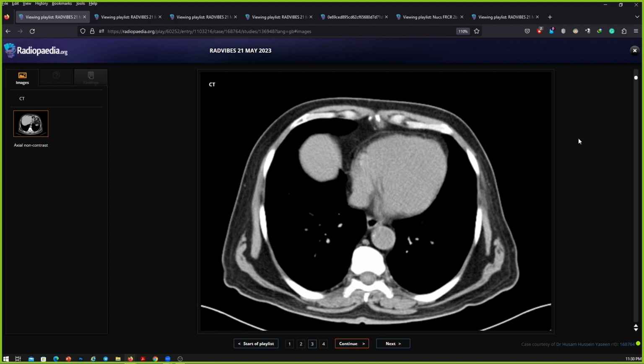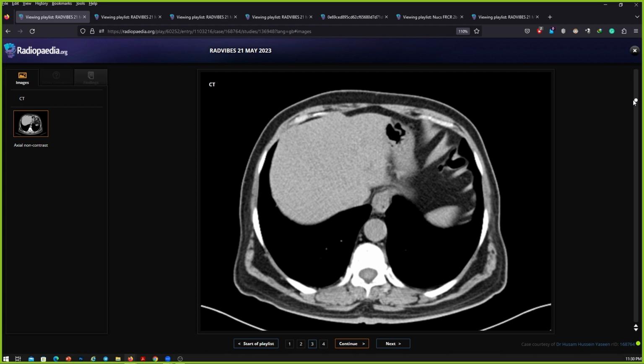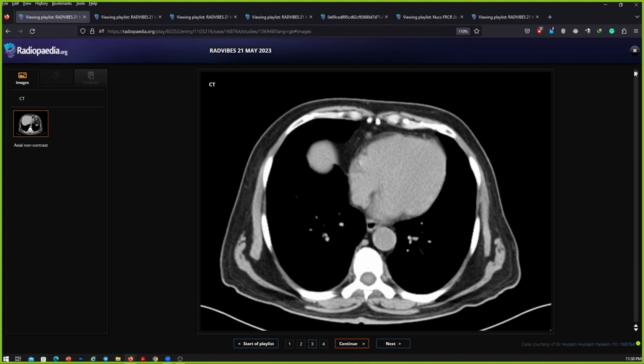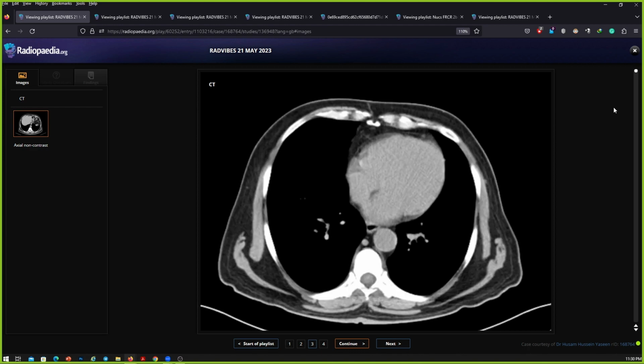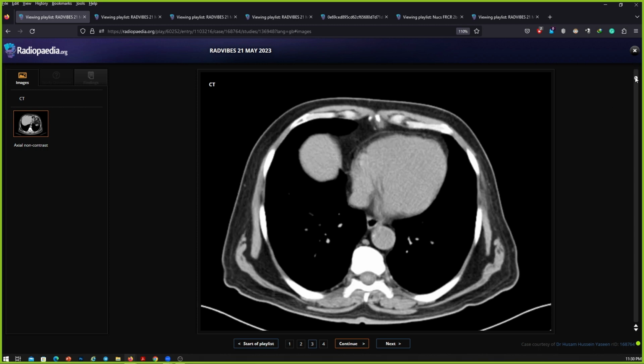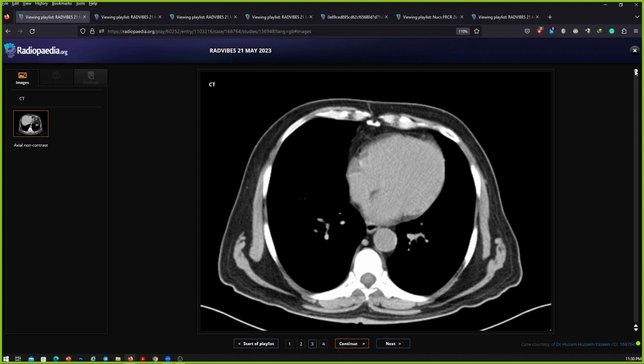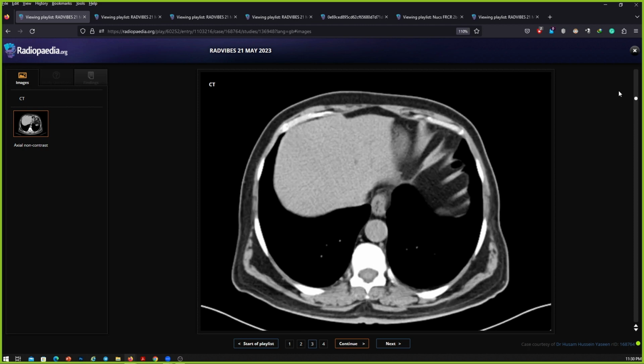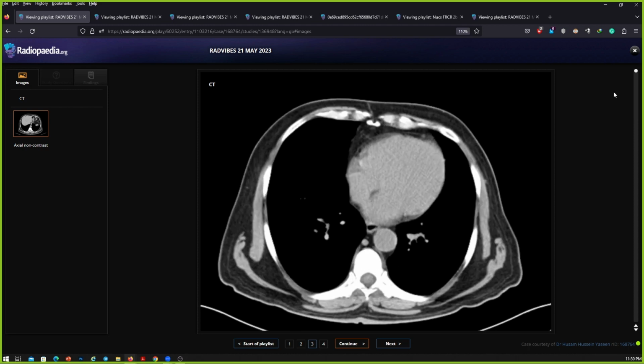You can either use this method that you're seeing on the screen, or if you have a mouse, you can just scroll up and down. Or the third method, something which I use in my exam, was to use the up and down keys. Please stop there. I haven't started your timer yet. I was just checking that you were good to go. So I start your timer now and you can start scrolling.